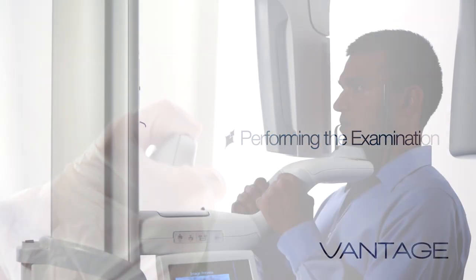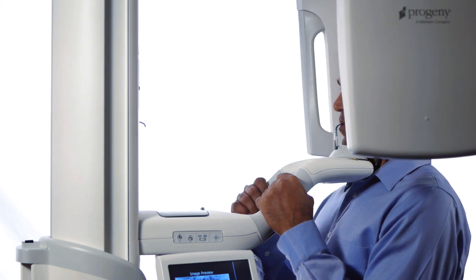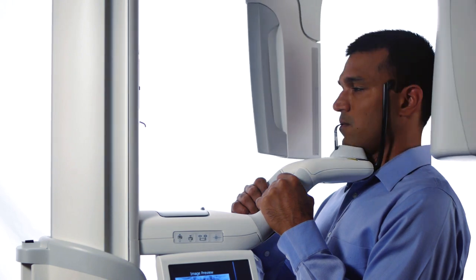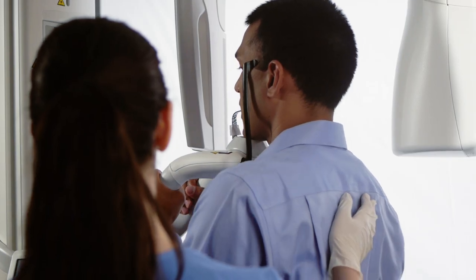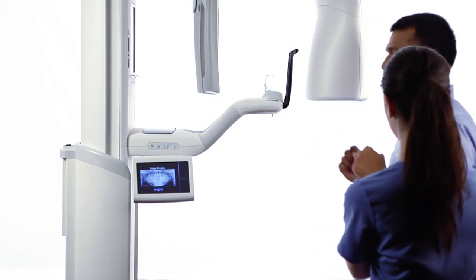Perform the examination. At the end of the exam, the overhead structure drives to the patient exit position. Advise the patient to remain in place until the overhead comes to a complete stop. At the end of the return movement, the head positioning wands will open. Assist the patient in stepping back and out of the structure.